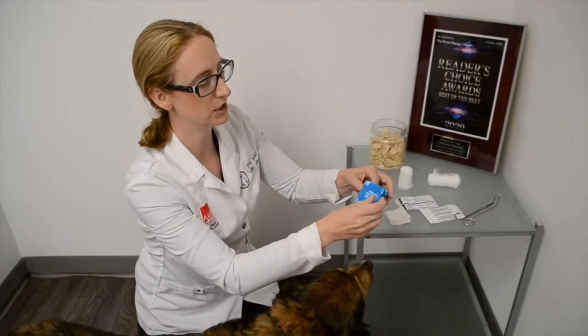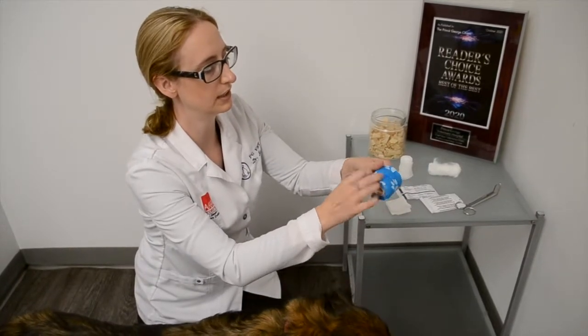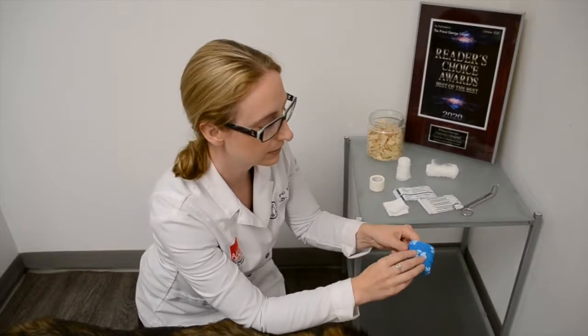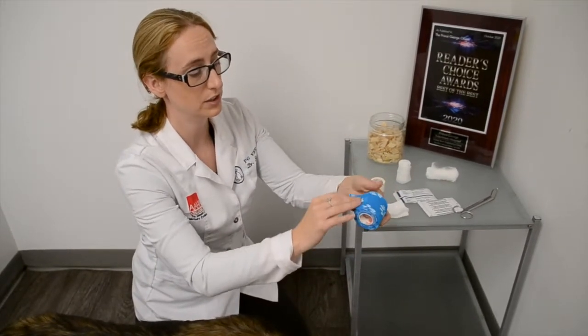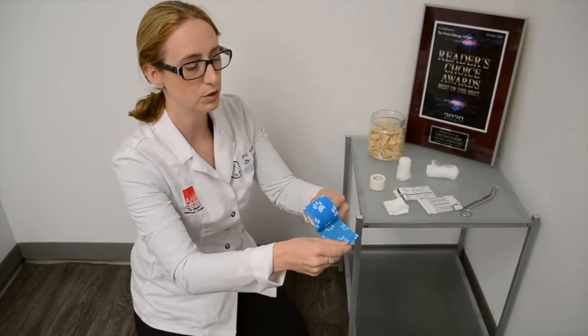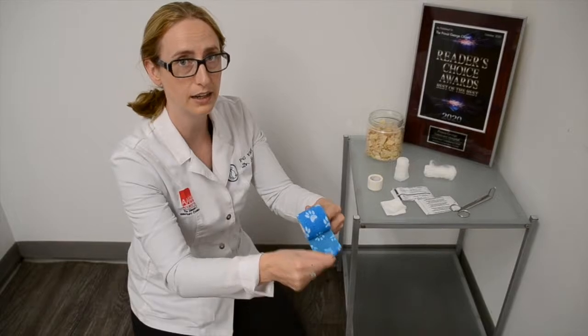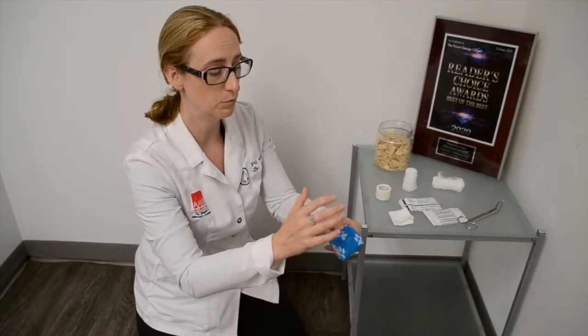Here we have some vet wrap. This is really stretchy material. It stretches and it sticks to itself, so then you don't need any connectors. Now the big thing I will say for this is, remember, it stretches but then it shrinks. So if you're bandaging a delicate area like a tail or a foot, you have to remember you don't want it to shrink too tight and then cut off blood supply, because you can actually damage tissue with bandages.